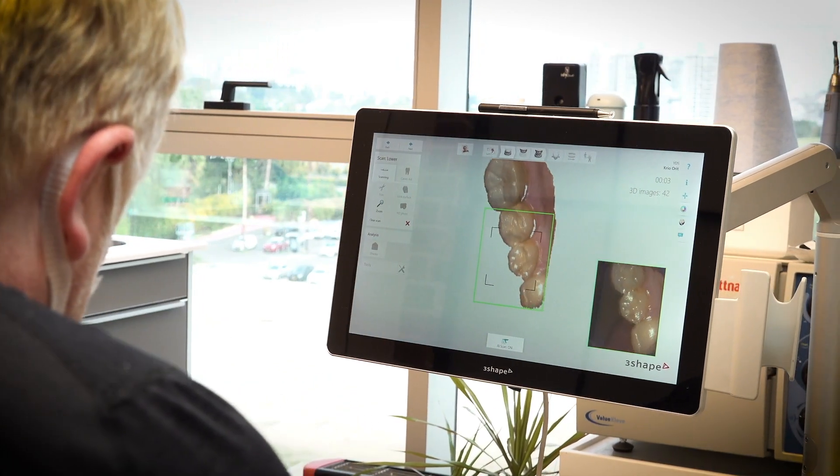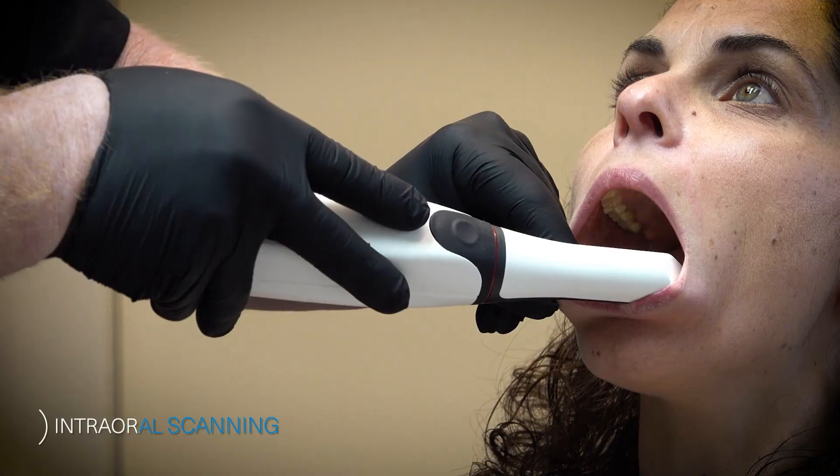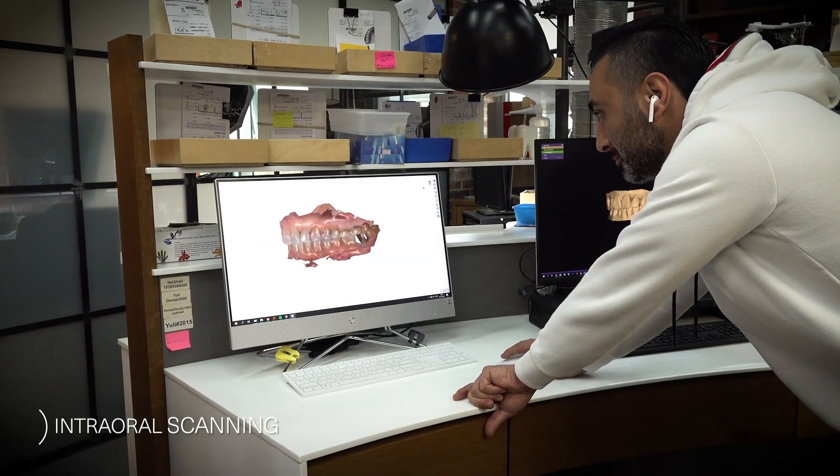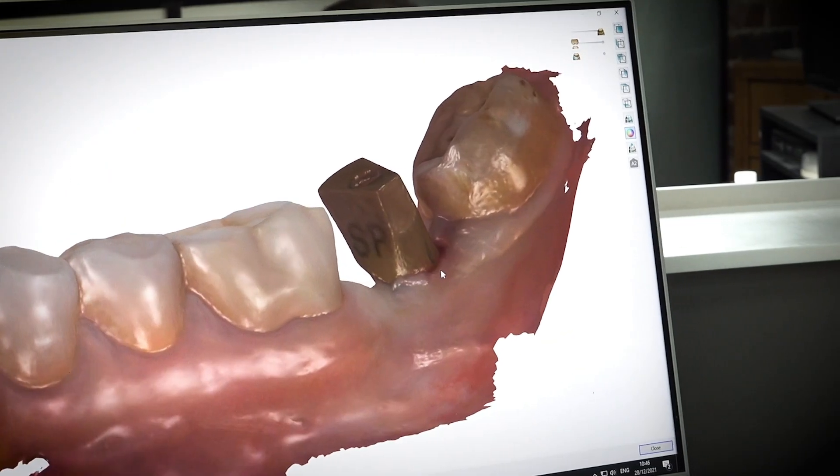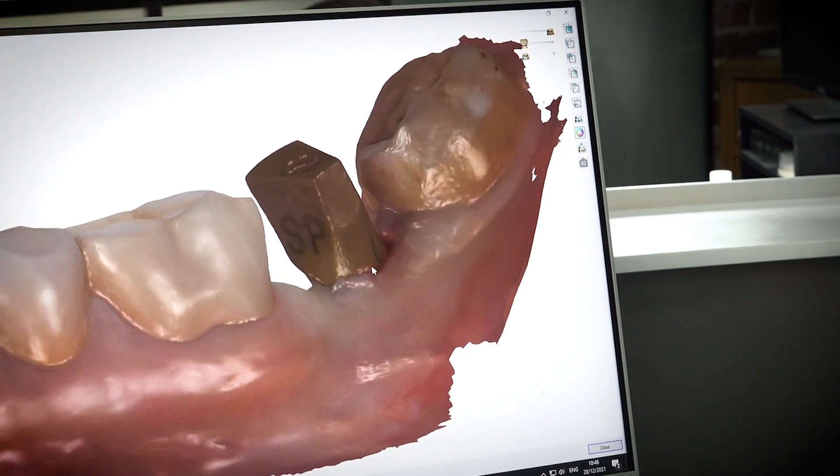An intraoral scanning of the patient is being done at the clinic. Digital files of the patient's intraoral scan are sent to the lab to be uploaded to the CAD software.